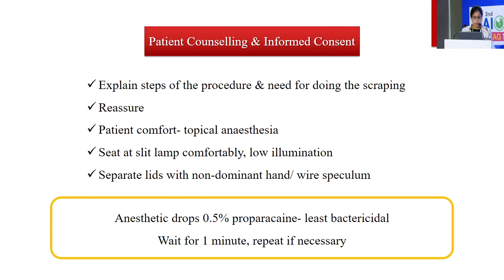Before you start scraping, counsel the patient, take an informed consent, explain the steps of the procedure. Just don't go ahead with a needle or a blade to the eye. Explain first. Patient comfort is important. Typically, scraping is done on slit lamp under topical anesthesia. Anesthesia in itself may be bactericidal, and topical proparacaine 0.5% has been shown to have the least bactericidal activity. So put the appropriate anesthetic drops, wait for a minute, and then start scraping.